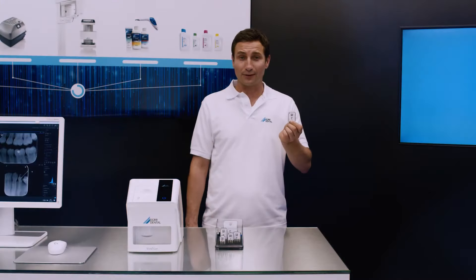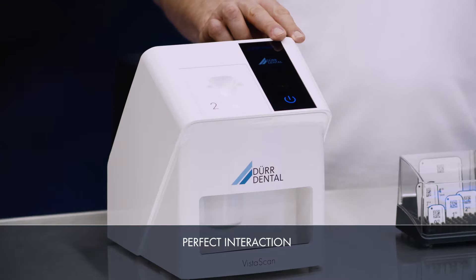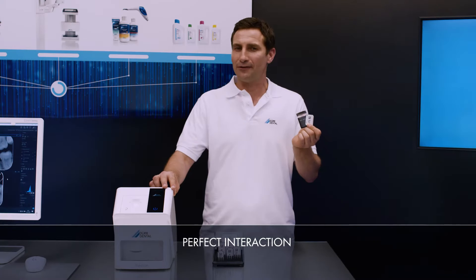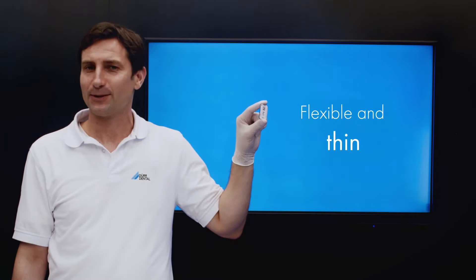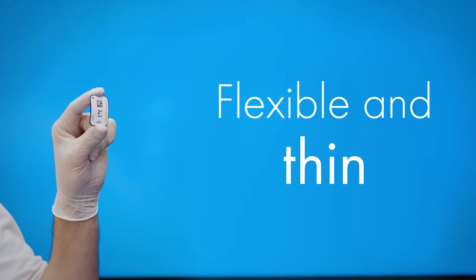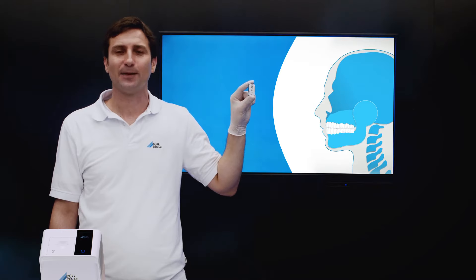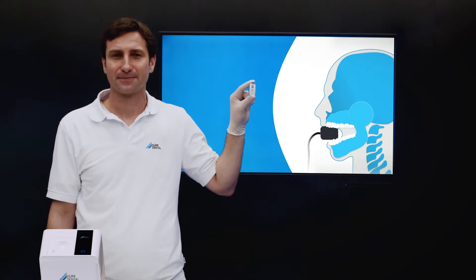VistaScan Image Plates IQ, Dürr Dental Light Protection Covers and the VistaScan MiniEasy 2.0 — a perfectly coordinated system designed to deliver the highest image quality. VistaScan Image Plates IQ are thin and flexible. Thanks to this flexibility, they are notably easier to place in the patient's mouth than, for example, a sensor with rigid housing. In addition, VistaScan Image Plates IQ have 100% active surface, unlike sensors.